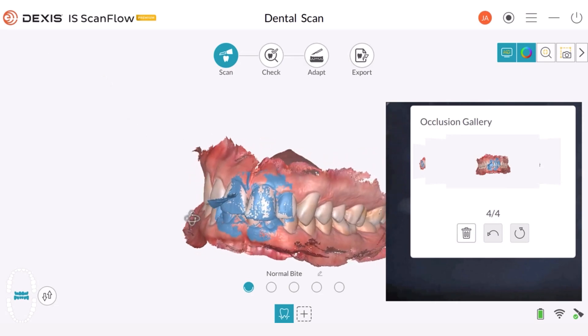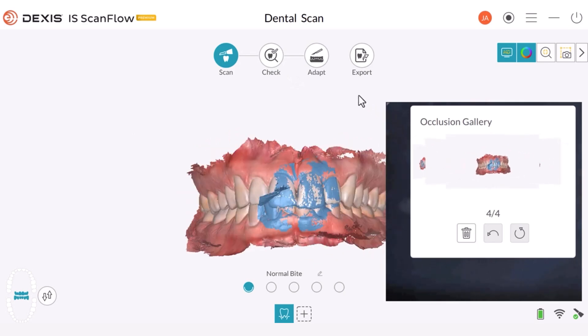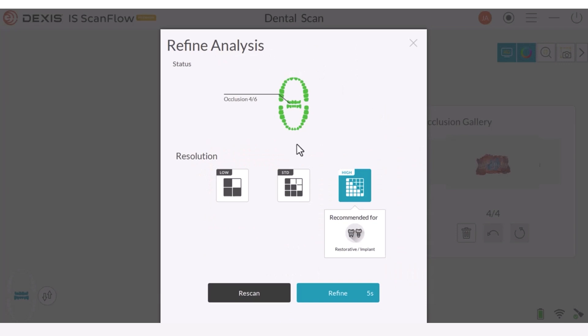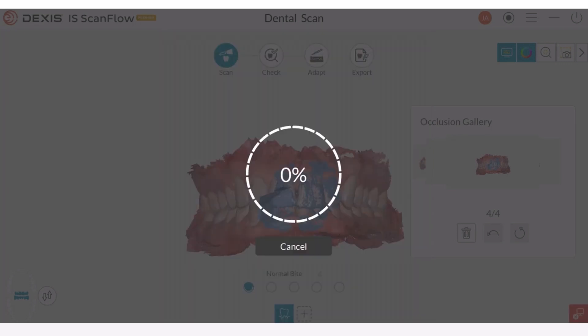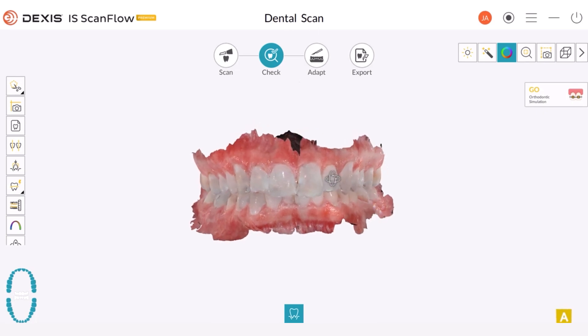Once you've finished, you can check your captures in the occlusion gallery. If everything seems fine, proceed to the check step and the refinement process will start. Once the refinement is completed, you can preview your bite registration.